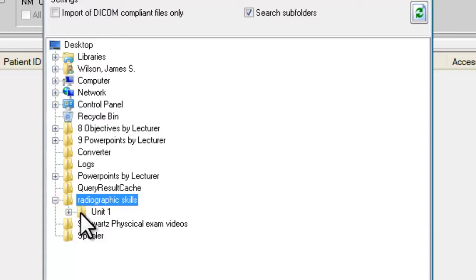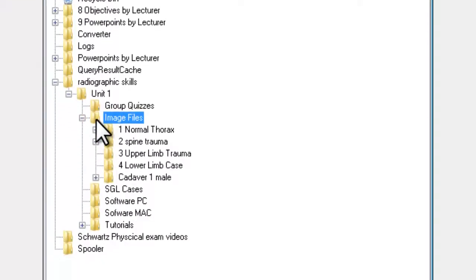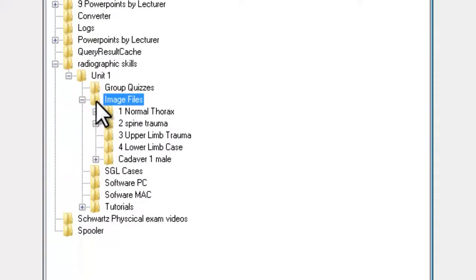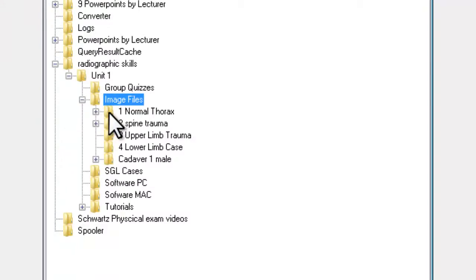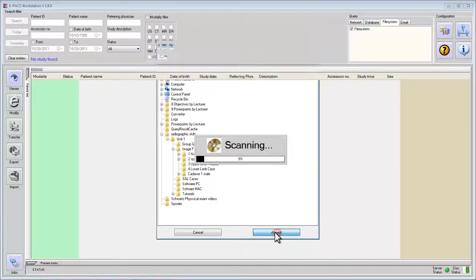I click on Unit 1 to open that up. Then I go to Image Files. Now I have, under Image Files, five different image files. We'll start off with number one, Normal Thorax. We click once and we say Accept.